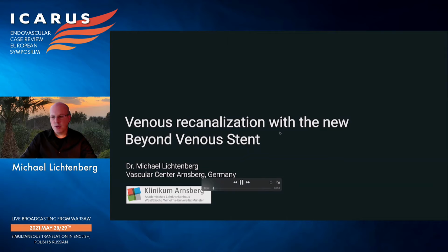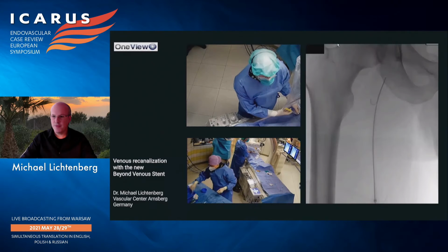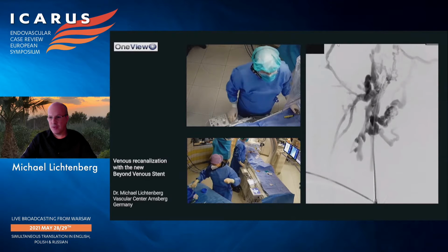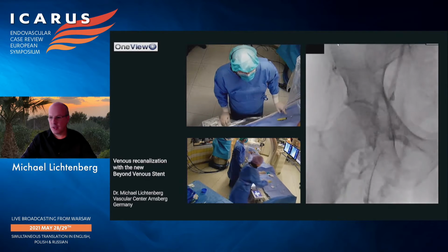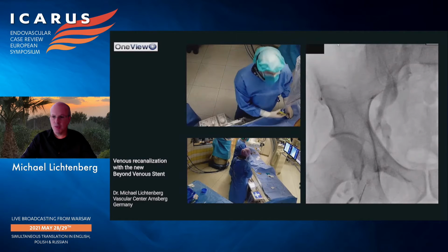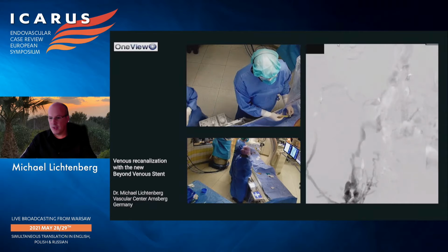It's now a pleasure to show you a recorded case, which we recorded actually these days, so quite live. So young patient, post-IV drug with an occlusion of his right common femoral vein. We are fully aware of all these patients having severe post-thrombotic syndrome after a long period of IV drug abuse.